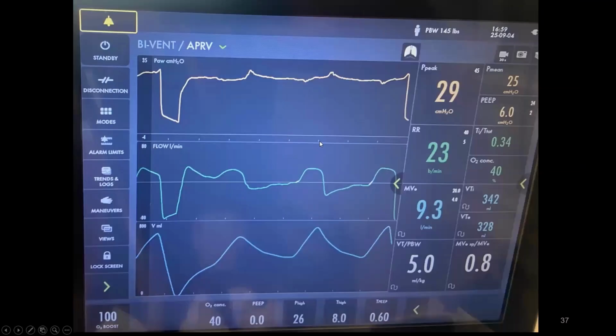And when you wait a few minutes, now this is the same exact patient. You see now we went from 6 to 8, but notice how the volume is consistent and the rate is consistent. See how they're emptying to the baseline, 45 degrees? And look at the volume consistent in the lung. This is maintaining that FRC standard. Okay, this is what you're looking for on a patient. Again, you have that empty. Notice it never gets to zero, right? Because of the time low, it never gets to zero. And then when it inflates here, you can see that patient taking nice, normal, spontaneous breaths.